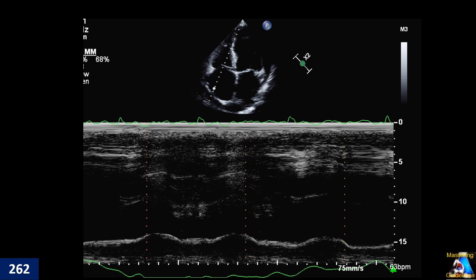One of our studies uses M-mode on the pericardial effusion. Here we can see apical four-chamber view, and we did M-mode here. Why do we do M-mode at this level, and what is the finding probability?